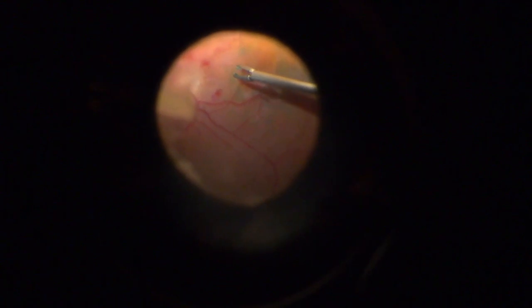Little better focus. I don't think so. We're going to use the pressure a little bit there for that hemorrhage in the macula, right? This more robust membrane is definitely going to cause a little more bleeding.